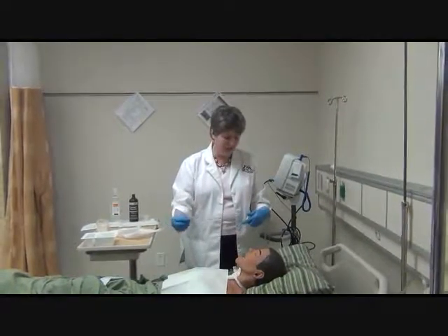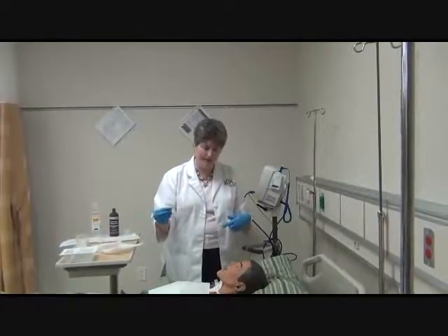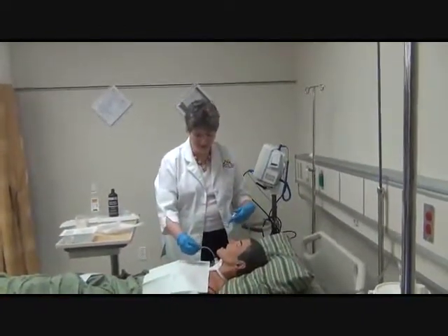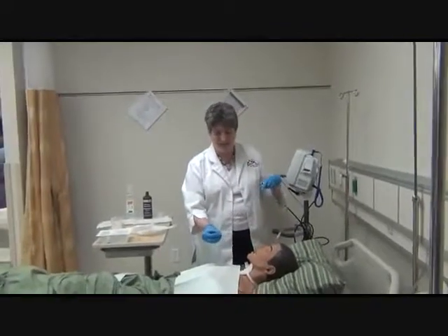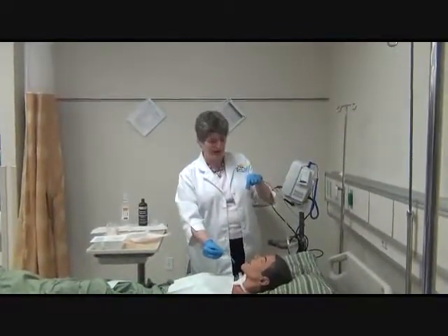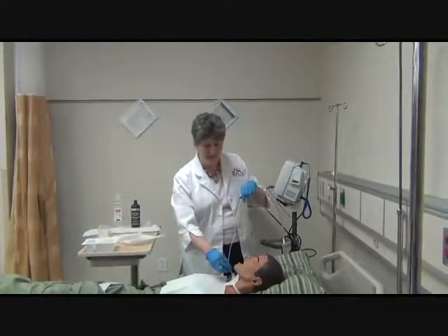So we're going to get ready to go down, and I've kind of marked the length I think that it needs to be. I've pulled off the little mask, and the easiest way to do this is to stretch out your catheter. So I'm going to go in.